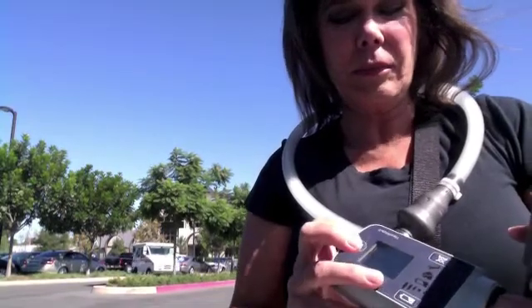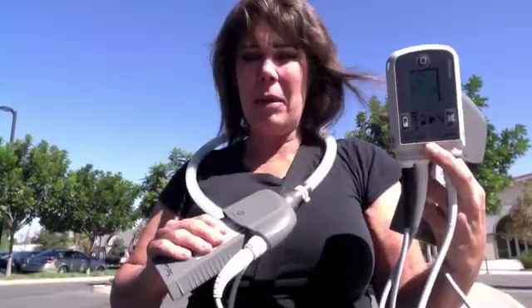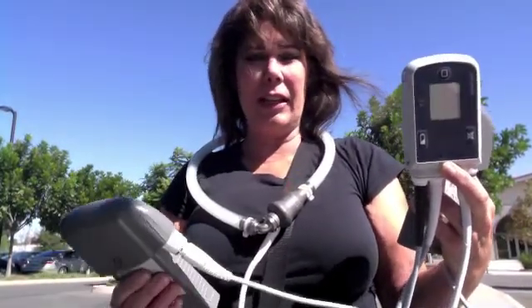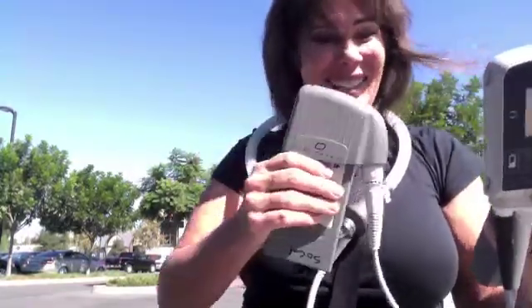It's called a pocket controller. It weighs about 1 pound. It actually has different readouts on it, so you can see how your device is working. And here's what the batteries look like. And there's 2 batteries. Always have 2 batteries. So I'm carrying around about 3 pounds, and this maybe weighs a little less than 1 pound inside, so I'm a little 4 pounds heavier than I normally would be, which isn't good for a girl.